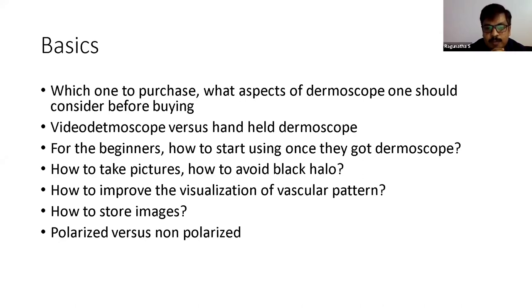Okay, is it possible, using polarized or non-polarized, to differentiate epidermal and dermal? For example, we have a question like white structure due to collagen or keratin, because keratin is usually superficial and collagen is in the dermal. Is it possible to differentiate using polarized and non-polarized? Because both will be, as Nikam sir told, amelanotic. We can make the differentiation if we use polarized and non-polarized, because polarized penetrates deeper and we can visualize the deeper one, and the non-polarized is the superficial one. Can we differentiate using polarized and non-polarized?